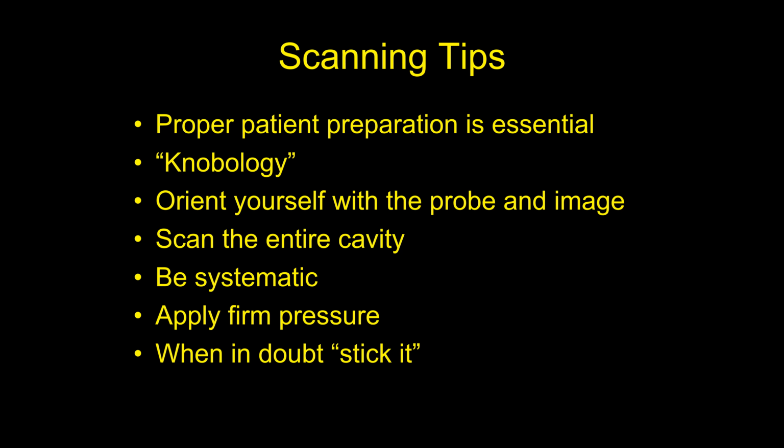Very rarely you will do a focused ultrasound, like let's just look at the bladder and look for a stone. Or maybe you had a dog that had a tumor in the bladder and it got removed and he comes back 6 weeks later and you want to just look at the bladder and see if there's evidence that the tumor or the stone has come back. Then you can just do the bladder ultrasound. But for the most part in veterinary medicine, we typically want to scan the entire abdomen at the same time.